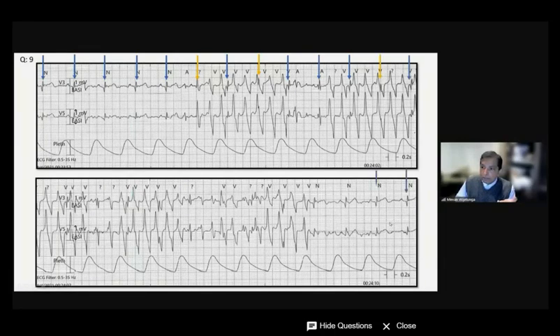Start from here. Now this looks like a jungle. How do you know? So you try to march them through. I don't know whether there is something there because it's not sure, but after the fact, this sharp signal may be the same here. I go there. But now suddenly I see, the caliper exactly takes me to this spot. That QRS is the same as that. Earlier I didn't see that. Only the caliper helped me to see that. And maybe it is down going, but the caliper takes me there. Maybe the down going part is the same as that one.